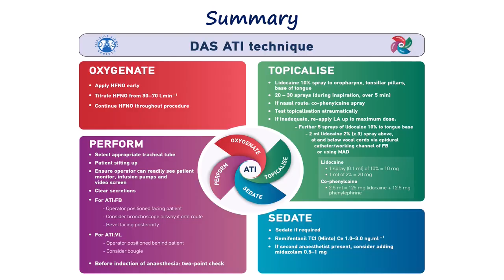We must also be skilled in prudent sedation techniques and in maintaining adequate oxygenation throughout the procedure. In addition, it is essential to understand and perform the techniques required for correct endotracheal tube placement. Mastery of these components ensures that awake intubation is performed safely and smoothly, with minimal stress and a high level of patient comfort and satisfaction.